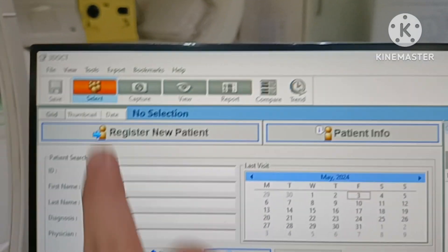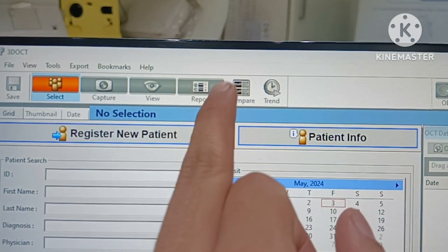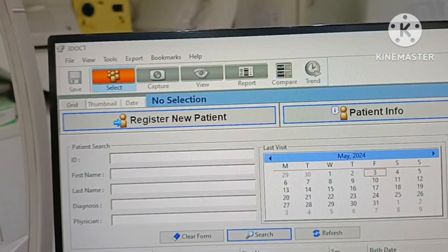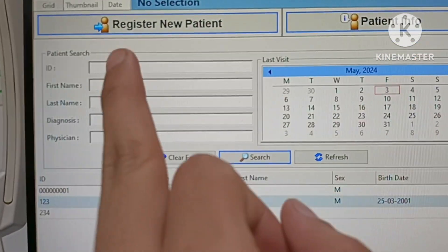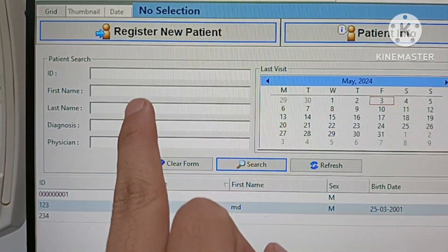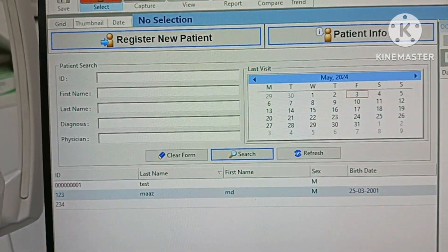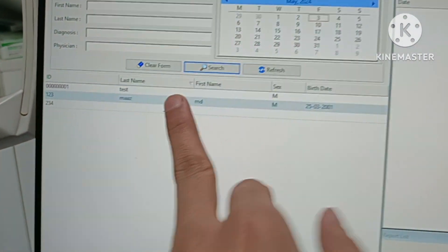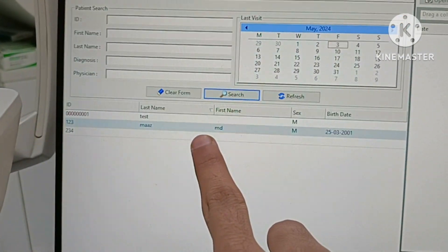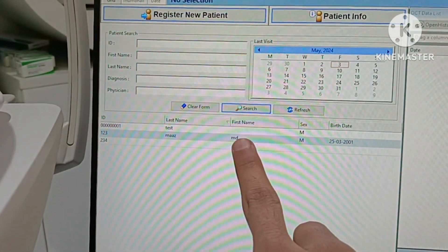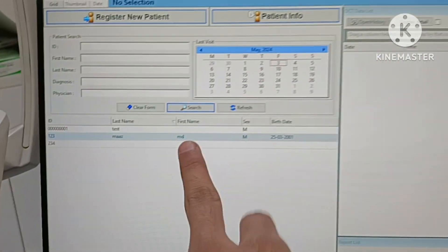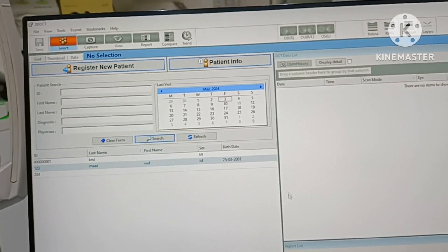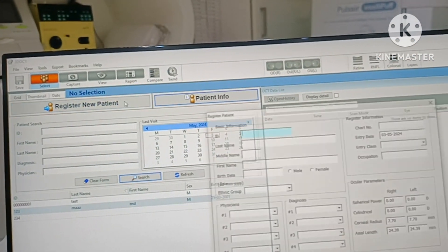Modes available: select, capture, view, report, compare, save file. Here is patient ID, first name, last name, diagnostic, position. There are 2 existing files available — I have taken readings for 2-3 patients already. Now first I will click here to register new patient.